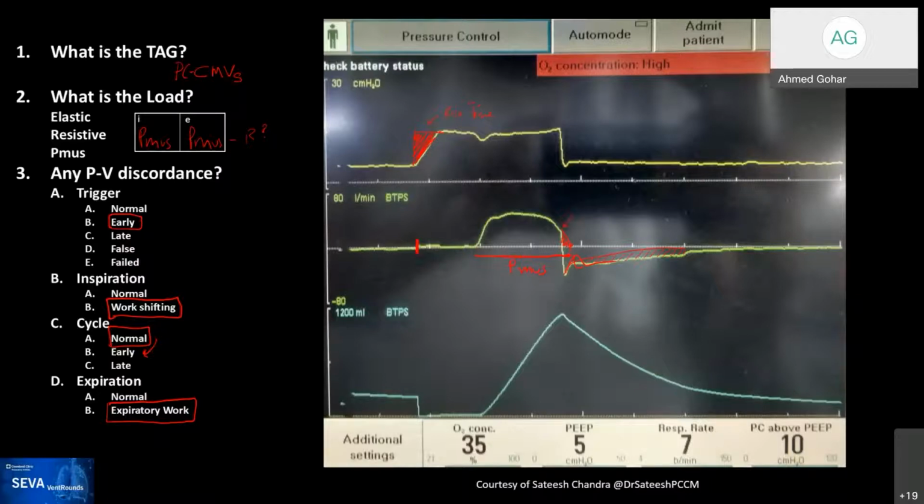I don't know. I do understand why this pattern here is labeled as reverse triggering, but I wonder if the reason for the pattern would have been something different than reverse triggering if it was biting. You know what I mean? And I don't know if you can inhale while you're biting at the same time. They seem like two things that are opposite to each other, which maybe if you're biting through the start of inspirations and by default you're not trying to inhale, then it is a reverse trigger.